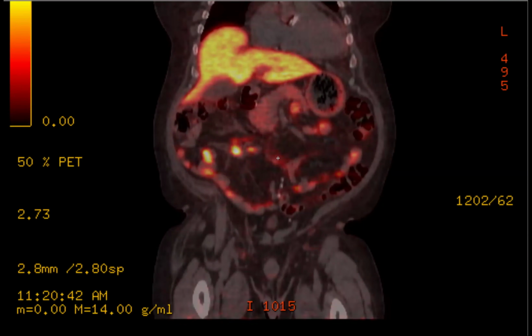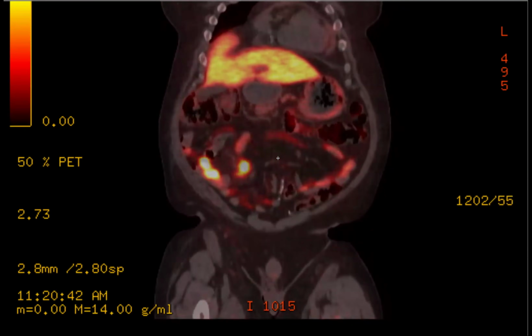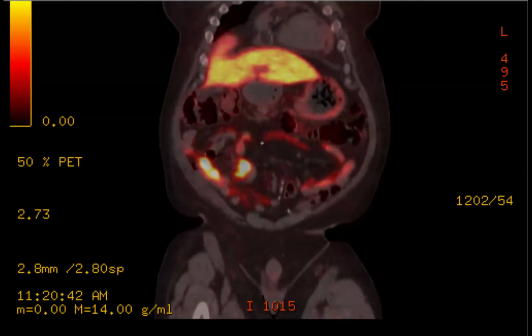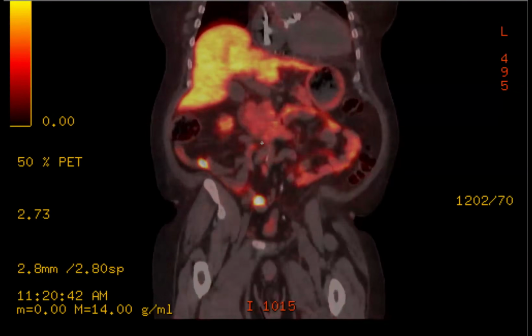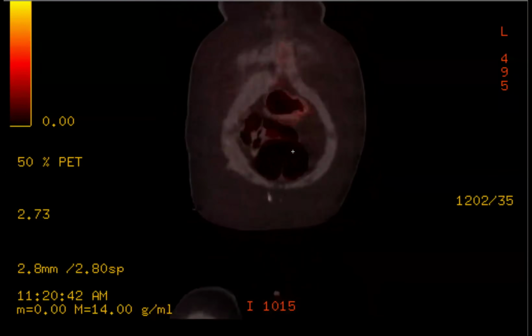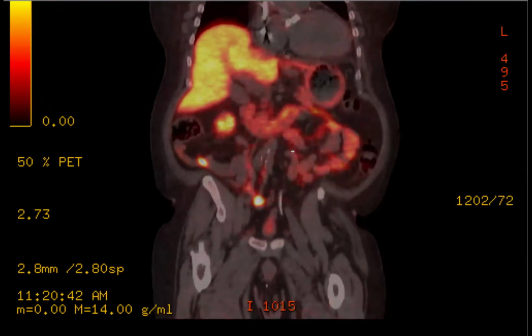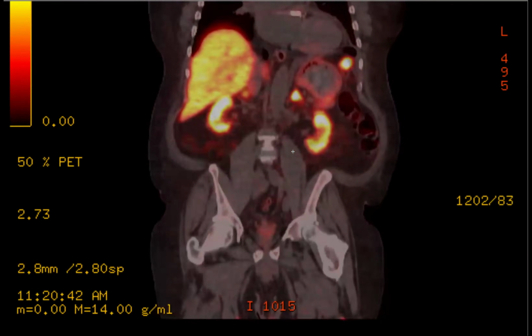I think dotatate can complement the surgical approach, to help localize the location and number so that you can have a complete resection. I asked them about that and they said, we have a better imaging study, which is our fingers. How do you look for nodes though? I mean, they're going to resect those nodes, but the major thing that we use dotatate for, which has been a game changer, is the extent of liver disease, but also bone mets, which I feel are really poorly seen on CT and MR. We've seen a lot of cases where there are bone mets on dotatate that we're not seeing at all on the other studies.